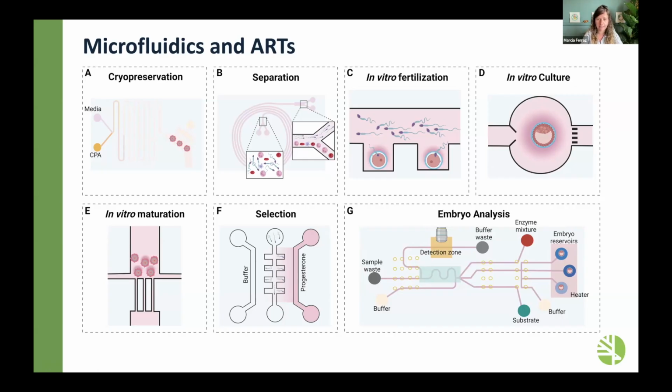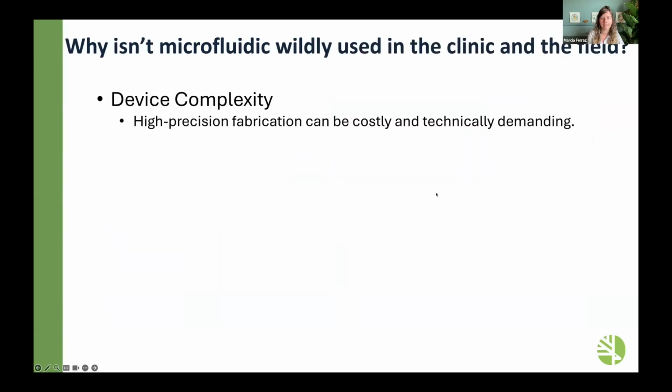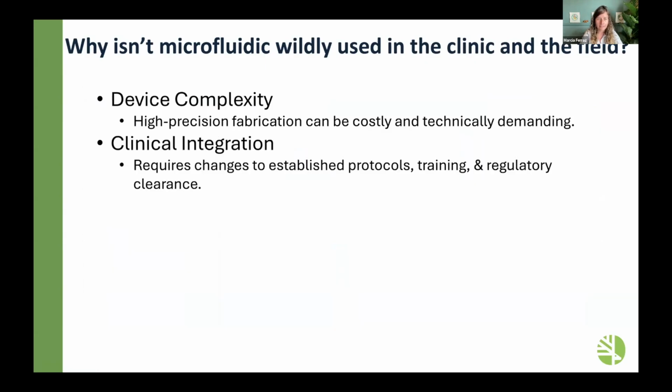And I think there are some reasons for that. One is complexity. For fabricating the devices, until a few years ago, we needed fancy equipment and clean rooms that can be really costly and technically demanding. Integrating into the clinic requires changes to normal protocols, training, and regulatory clearance, which makes it harder. So you don't want to risk changing something that has been working to a certain extent for something that can bring risks. There are a lot of steps until we can integrate those into the clinic.